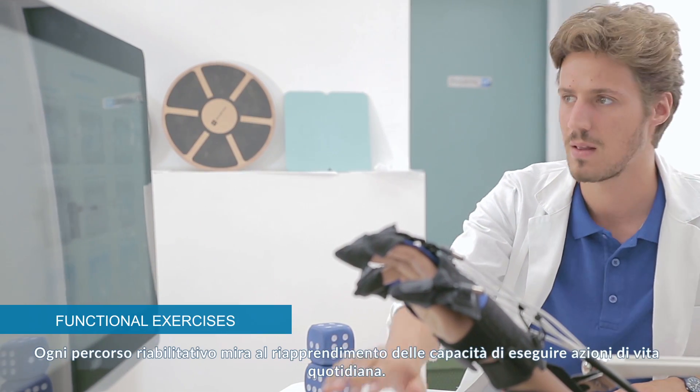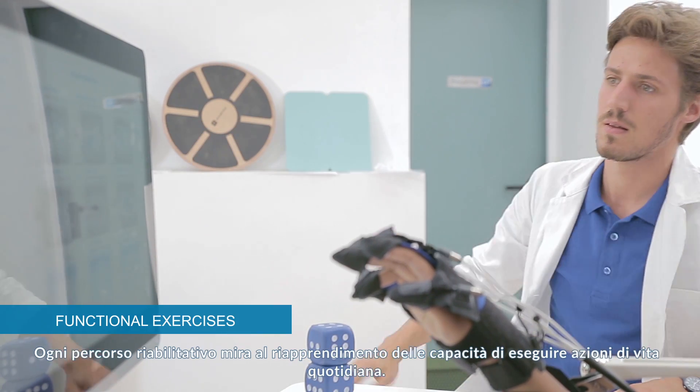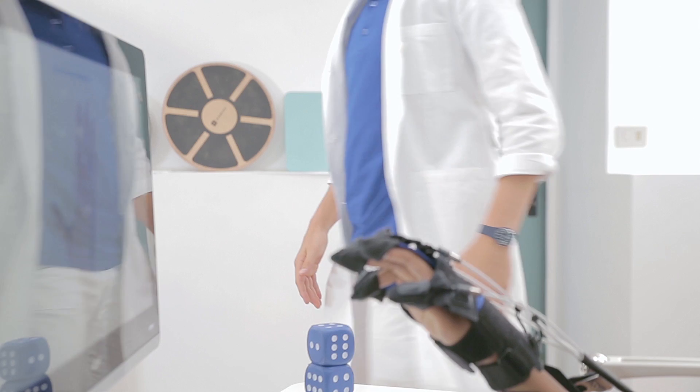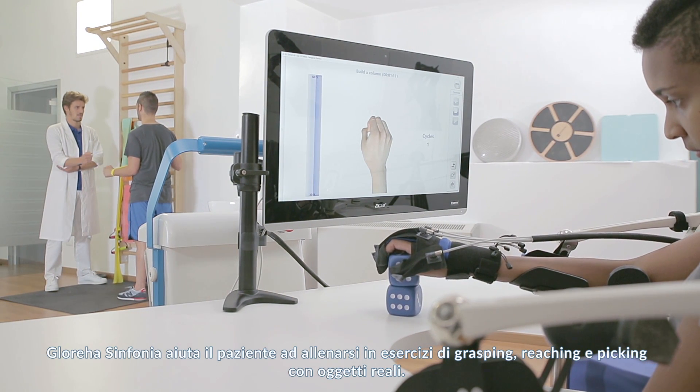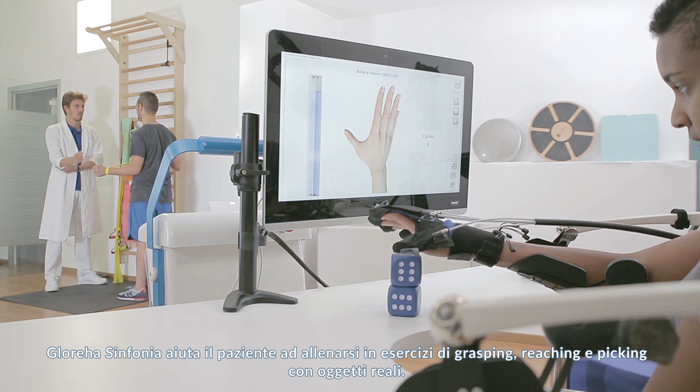Every rehabilitation process is focused on relearning the activities of daily living. Glorea Sinfonia helps patients with grasping, reaching, and picking exercises using real objects.